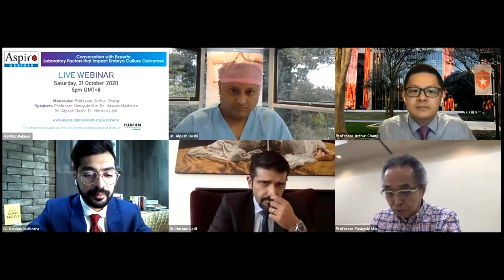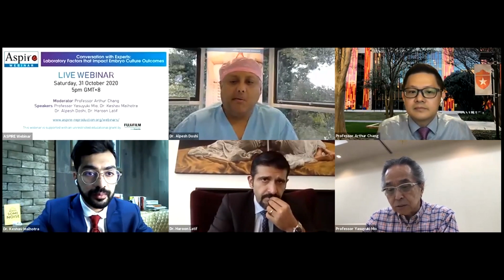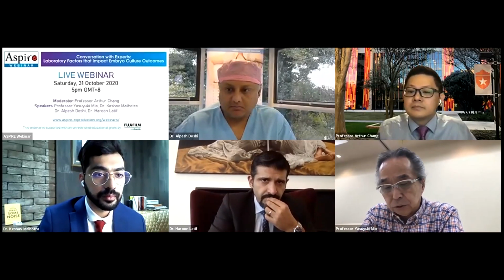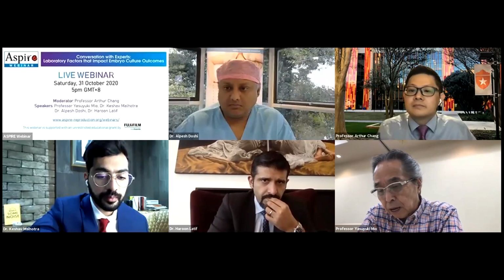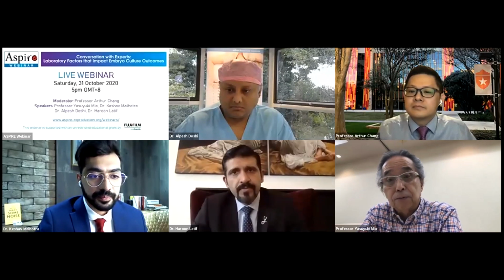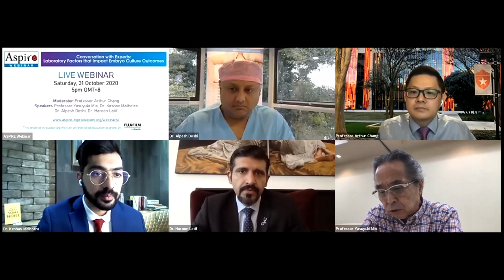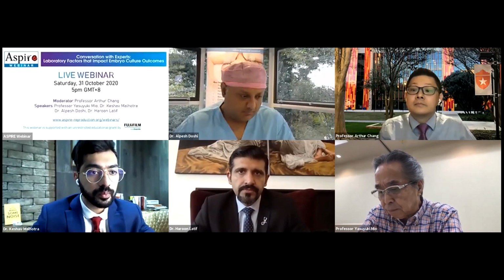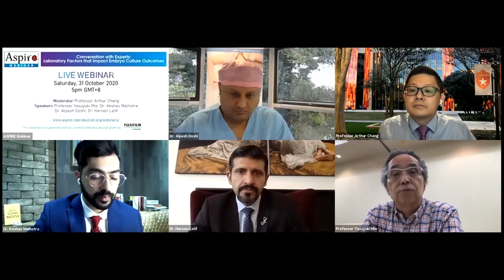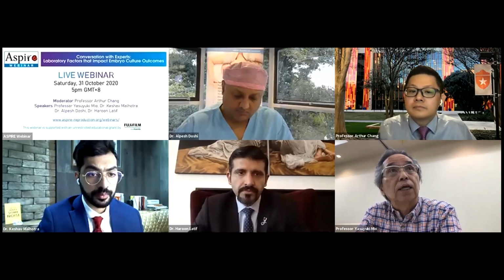Yeah, thank you very much for asking me. I think sterile water in the dry incubator evaporates very quickly, so it is not so effective. I think that the dense oil is much more effective for maintaining the osmolality. In addition, I think you should change the culture medium around culture day 3. It's very important, I think.